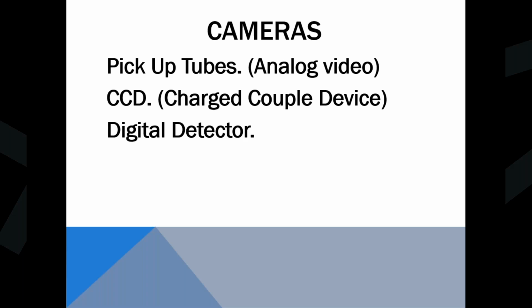They were 100% analog, but I'll actually say probably up until maybe 10 years ago, the images from the pickup tubes are actually better than the digital equivalent. The newer systems have picked up their resolution quite a bit, so the pickup tubes are kind of not the thing anymore. But they actually did make some really good images for their technology.